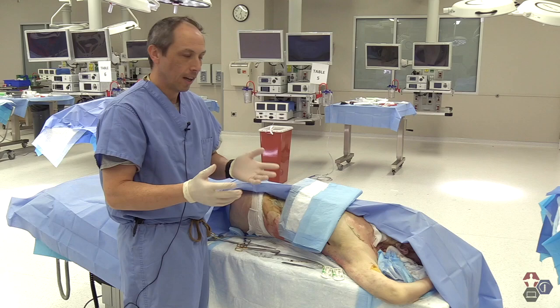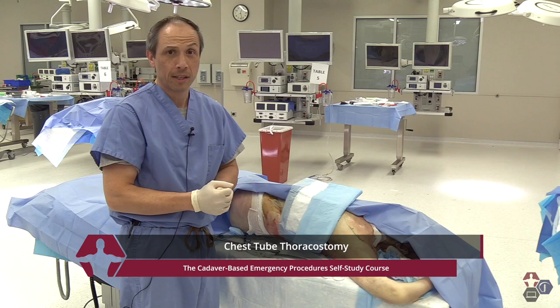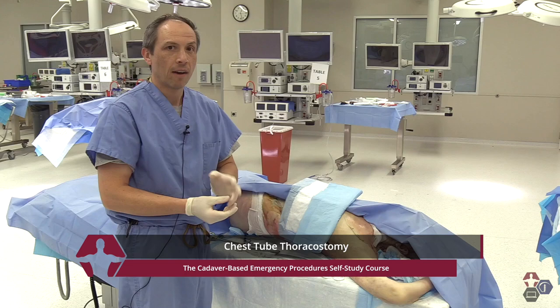Hi, my name is Raymond Merritt. I'm an emergency medicine physician here in Tampa, Florida. And today for this video, I'm going to show you chest tube insertions. We'll talk about some of the indications, the complications, and some of the potential pitfalls that you may run into.